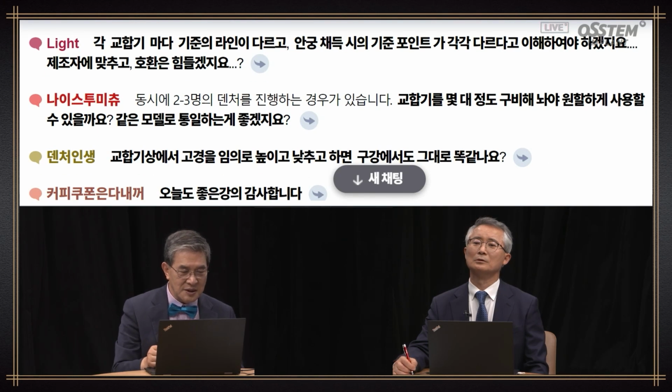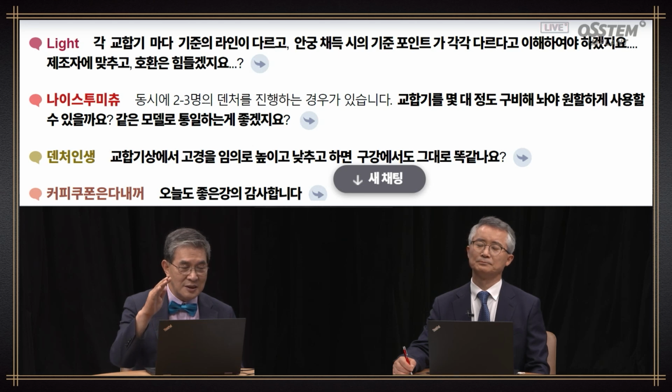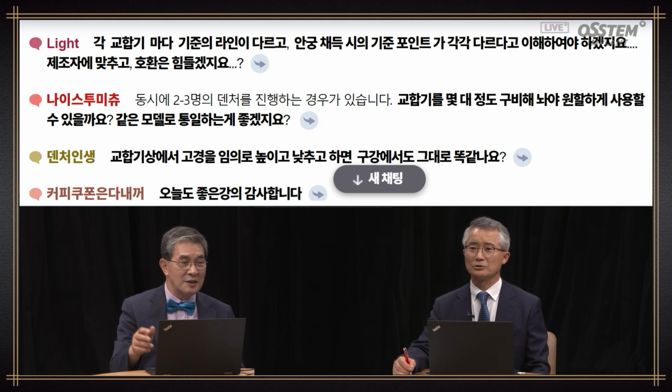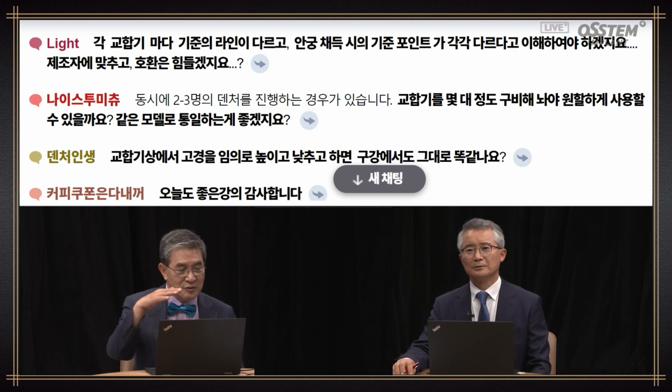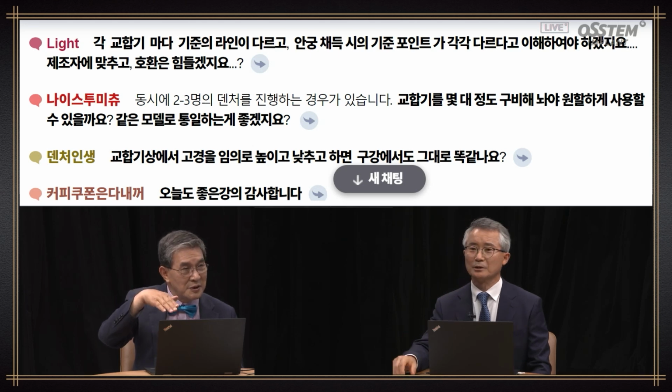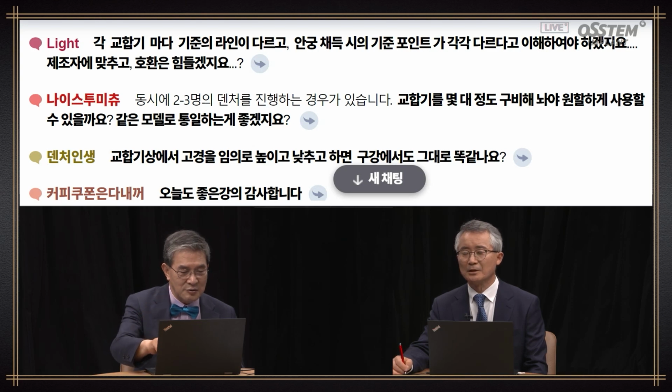There's a different reference line for different articulators, and there are different reference points when doing facebow transfer. We need to follow the manufacturer's instructions. Are they interchangeable? There are different series from manufacturers, and there can be interoperability within that. But if the manufacturer is different, then you will not be able to use them together. As for the reference points of the facebow, in certain articulators, the FH plane is used. In others, the Camper's plane is used. There can be differences.